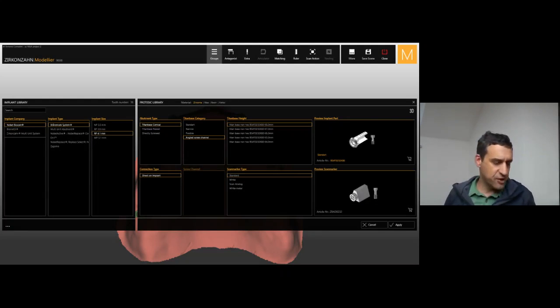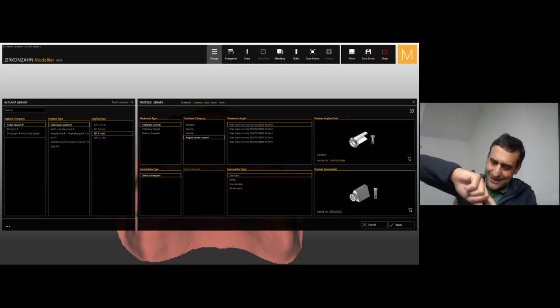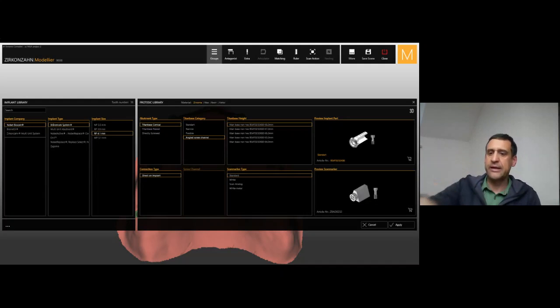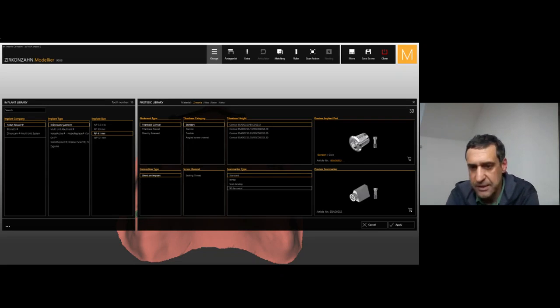Of course, there is a special screw which is rounded, and the screwdriver is also a different, round one, that allows you to come into the frame, into the base, angulated. It is engaged also when it's not straight, but a little bit inclined. So that's the K85. And you also have here, like the K80, different possibilities to cut it at a different level. That's interesting to know, that we have these options.